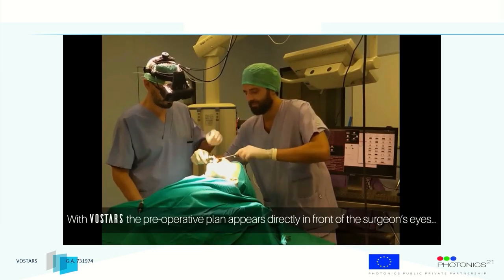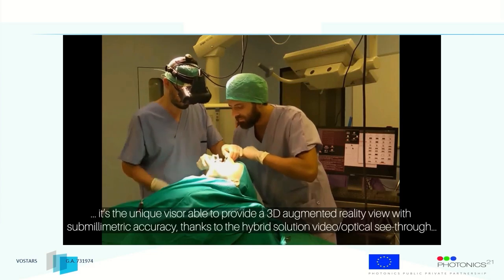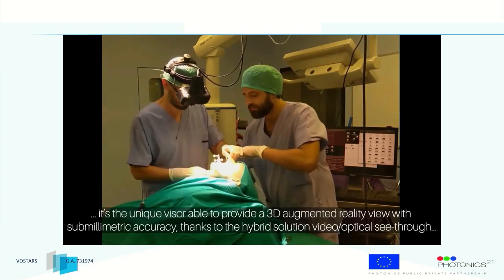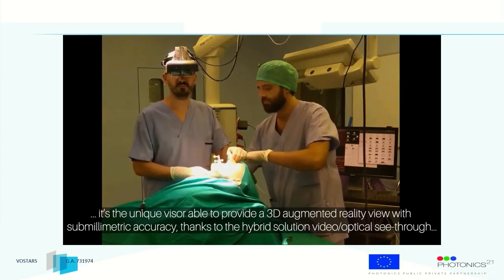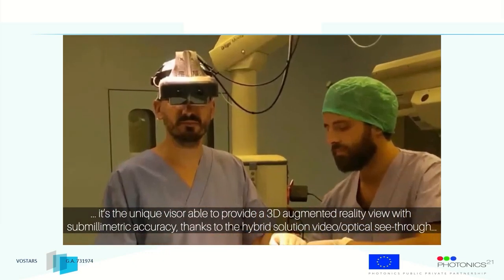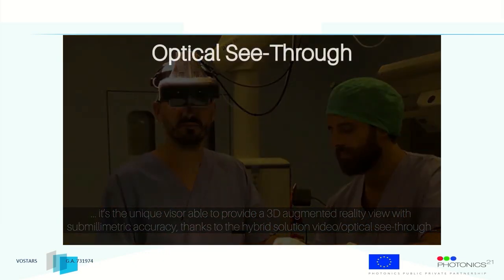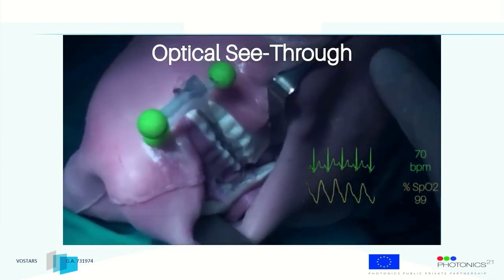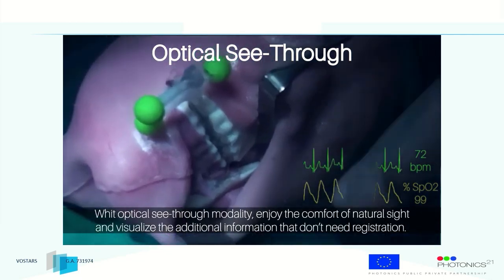You can see here a video acquired in a simulated environment over a phantom. In this case, the display is semi-transparent. You can see the eyes of the user, and in this modality, we can offer the surgeon additional information like the heartbeat, for example.